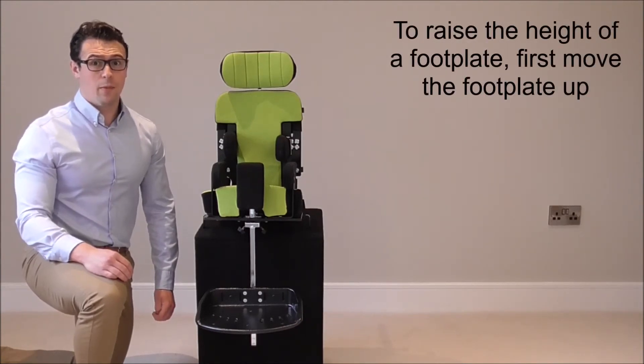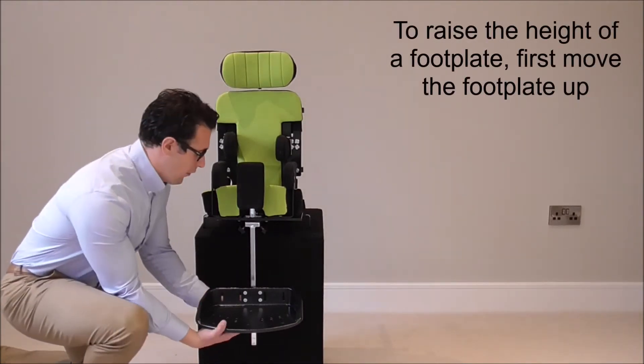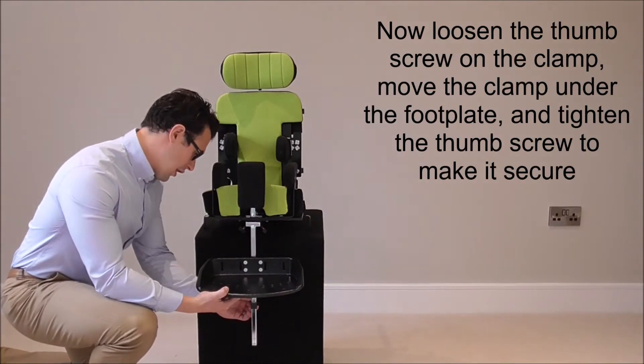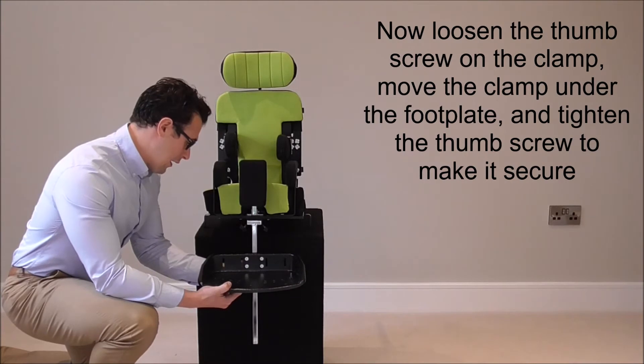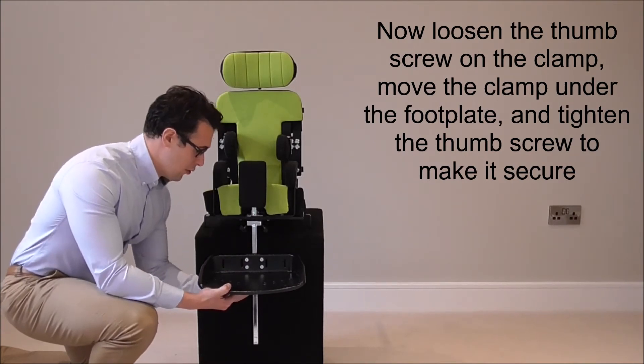To adjust the height of your modular foot plate, slide the foot plate up, then loosen the hand wheel on the clamp behind, slide that up and tighten it up to make it secure.